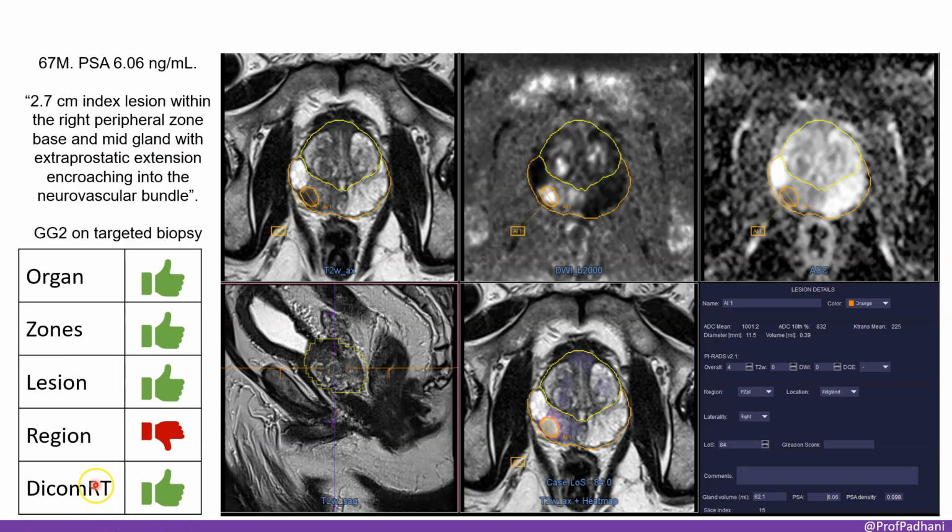Okay, slide 16 showed an example of typical AI output on a workstation. What were the key elements visible? Right. So in that example, you typically see a segmentation of the whole prostate gland, maybe the different zones marked out too. The anatomy outlined. Yeah. Then a suspicious lesion is contoured, highlighted somehow, and you'll usually see quantitative data displayed right there, things like ADC values from the diffusion sequences, lesion volume. The numbers. And crucially, there's that likelihood score or a suggested PI-RADS category, linked to that specific lesion.